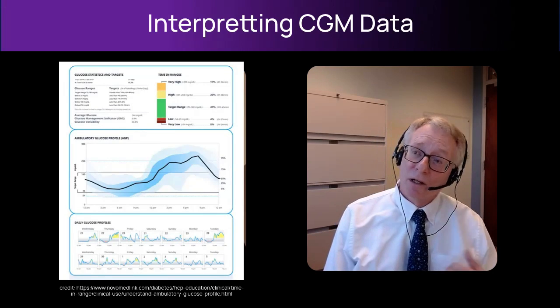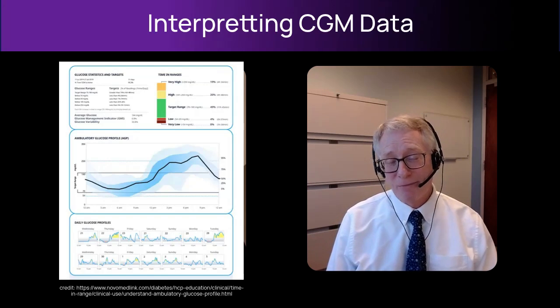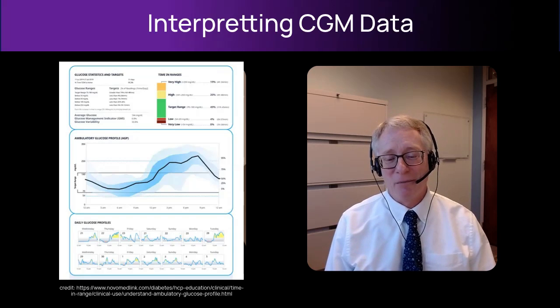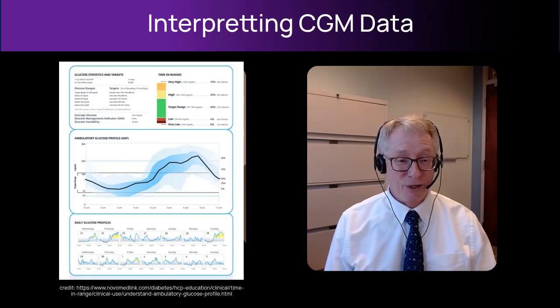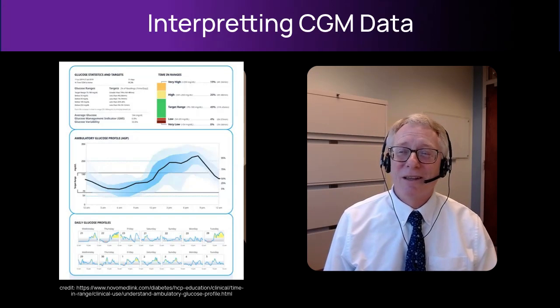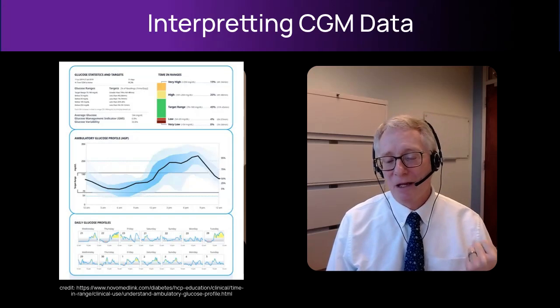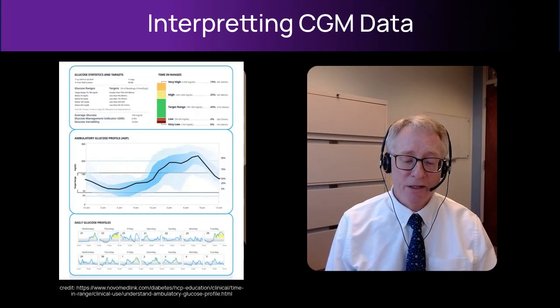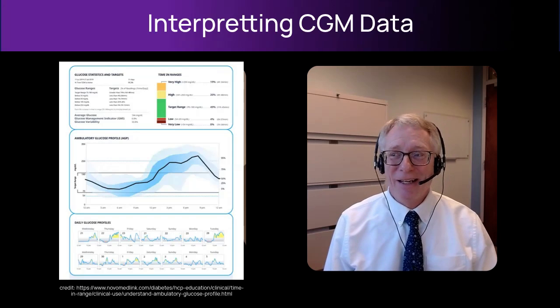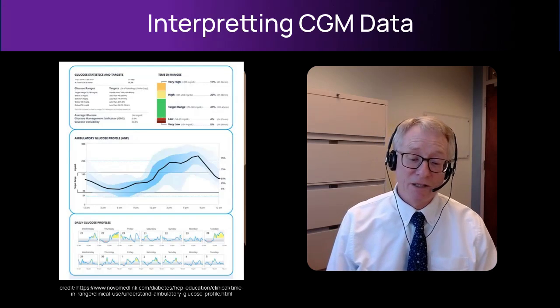It's not dangerous. We worry about it in diabetes because if you're treating people with agents that can cause hypoglycemia, which is insulin and sulfonylurea therapy, you want to minimize it because we worry that you're going to drop further than 70. So 4% is the threshold. You want to be under 4%. The reason it's not 0% is, A, in the real world, people drift below 70 all the time. And B, if you have type 1 diabetes, you're fairly sensitive to insulin. It's hard to get a time in range of 70% without accepting a little bit of drift below 70. And so less than 4% time below range.